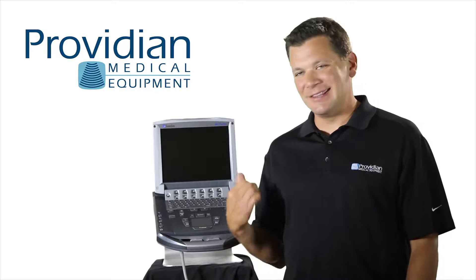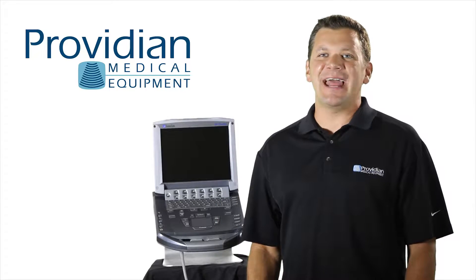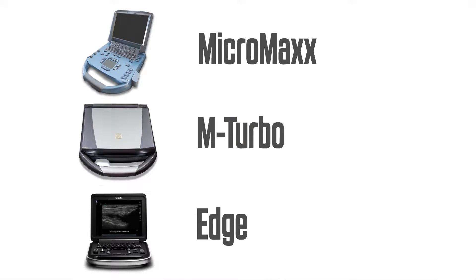Hi, I'm Brian Guell with Providian Medical and this is the Sonocyte M-Turbo Portable Ultrasound Machine. This is an excellent ultrasound machine with very good image quality and is a well-known solid ultrasound brand. The M-Turbo is an upgrade to the Micromax machine and the predecessor to the Sonocyte Edge.